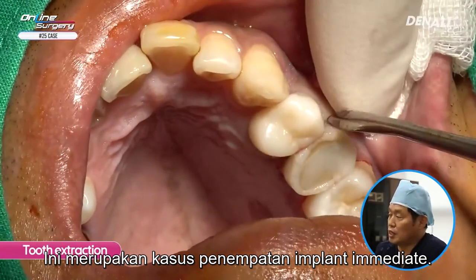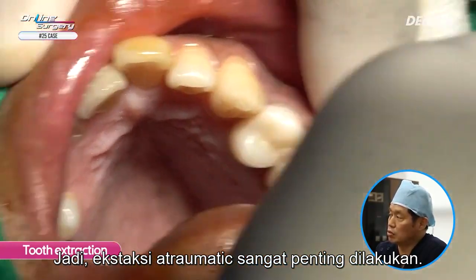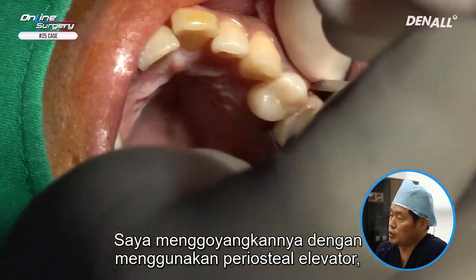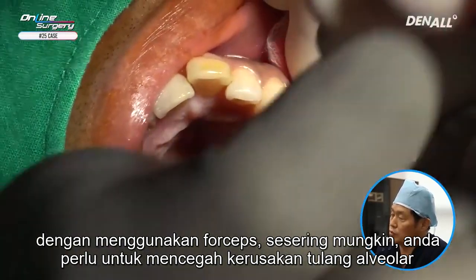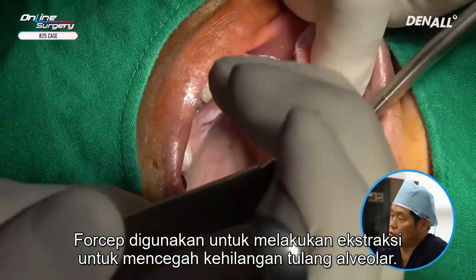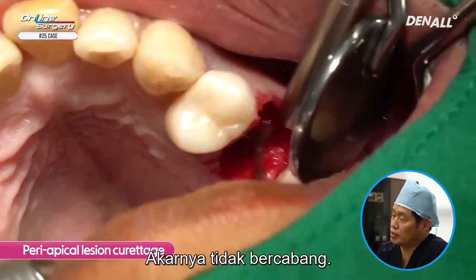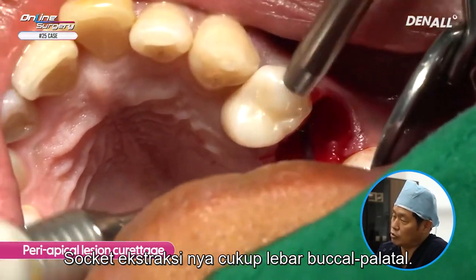This is immediate implantation case. So atraumatic extraction is very important. In the premolar area, if the distance with the mesial tooth is really tight, I luxate using periosteal elevator. Using forceps, as much as possible, you need to prevent any damage to the alveolar bone. Forceps is being used to do extraction to prevent any alveolar bone loss. The root is not divided into two. The extraction socket, buccopalatally, it's quite wide.